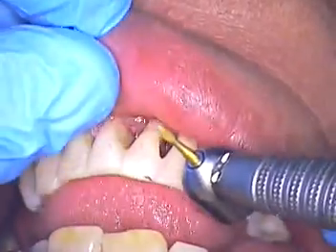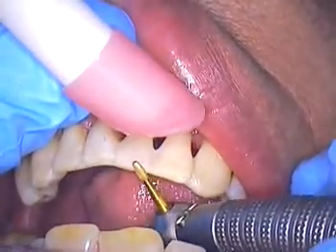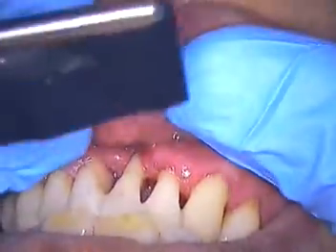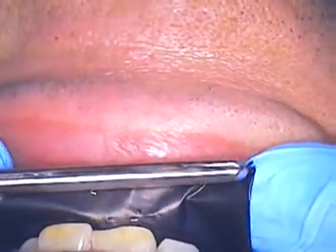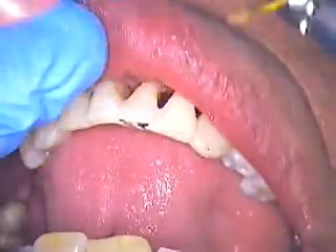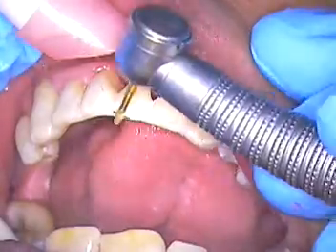Open up a little bit. Just going to adjust it a little bit. Now this is enamel — I'm adjusting enamel, so it's just beveling. Paper in again. Open. Close. Tap, tap, tap. Grind forward, backward, back and forth. Open. So you can see where he's hitting, just a little bit.